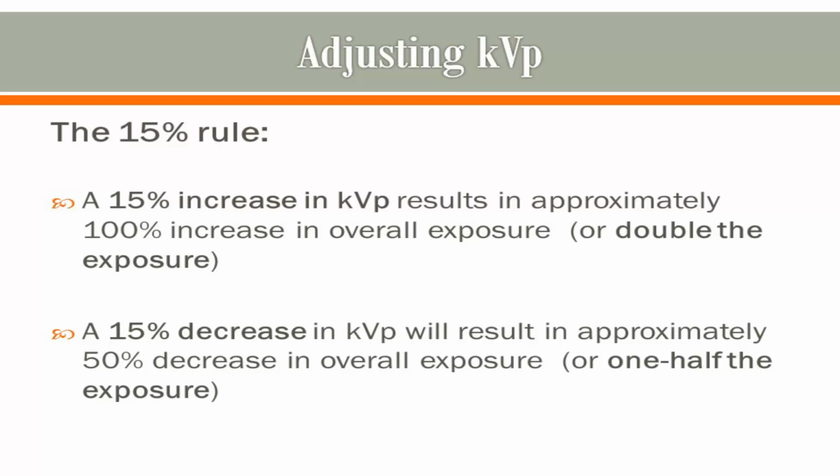So what do these changes do to the image we see on the screen? Probably nothing. The computer software compensates for over and under exposure well enough that unless your exposure is very low, that information is missing because not enough x-rays reach the image receptor, or so high that so many x-rays reach the image receptor that it is completely saturated, the image will appear adequate. Visually, it'll be fine. But we will talk more about this later.